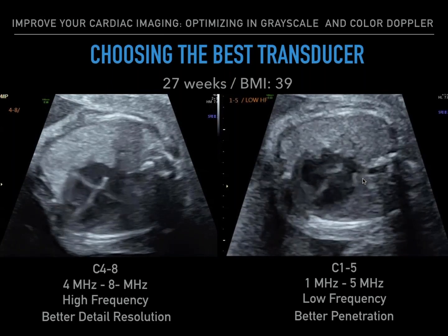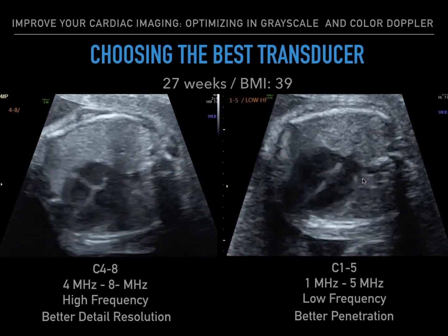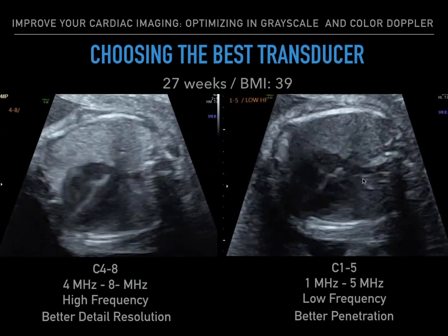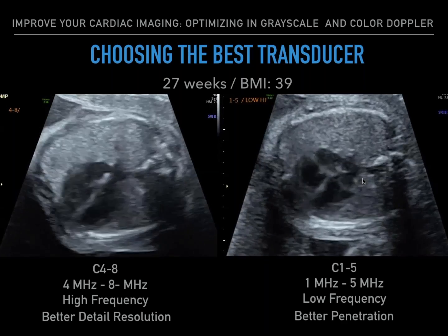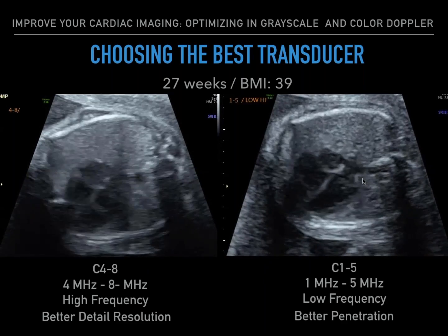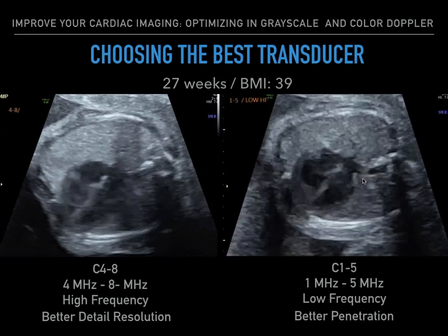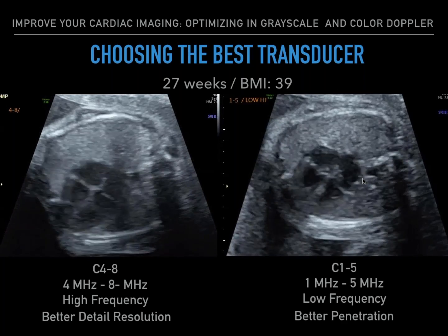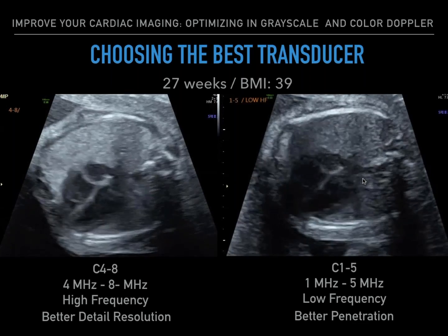Now it all comes down to choosing the best transducer. Here's a 27-week fetus with a patient BMI of 39 scanned with 2 different transducers. The C4 to 8 high-frequency transducer provides great detail resolution with a bit of shadowing as we pass through the ribs, and this is due to the reduced penetration. The C1 to 5 low-frequency transducer provides better penetration, as we can see a crisper view of the heart, yet resolution is slightly decreased, giving it a slightly grainy appearance. So again, it clearly depends what you are aiming for: better resolution or better penetration.